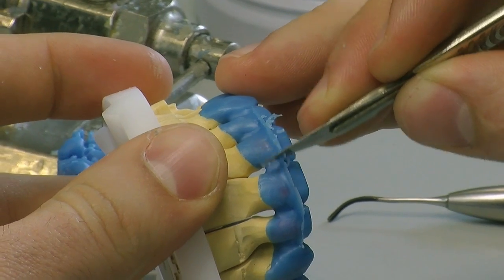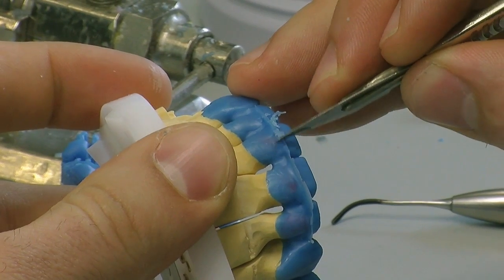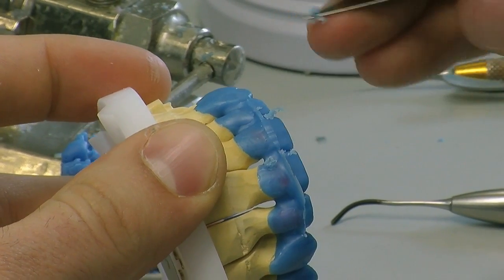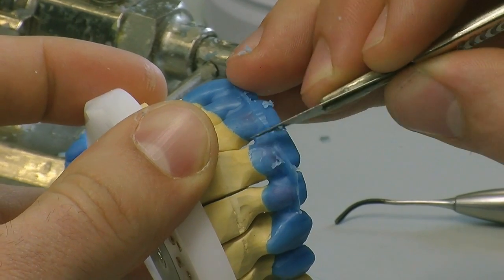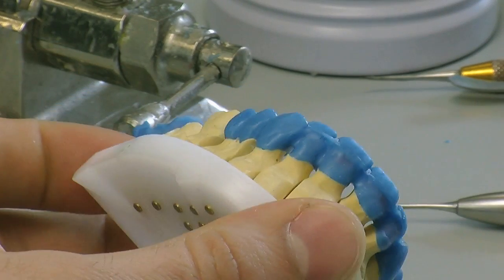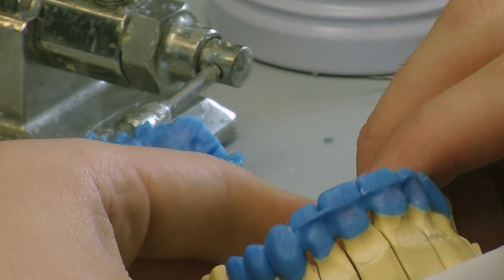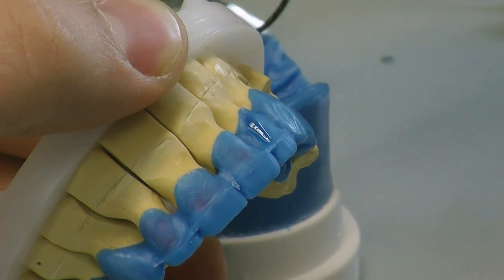The next stage is adding the mesio and distal line angles and building in the rest of the wax to give it the full contour shape that we're looking for. Then this will be checked on the articulator, and then we're going to do our cutback in the wax, which will allow for our porcelain application.